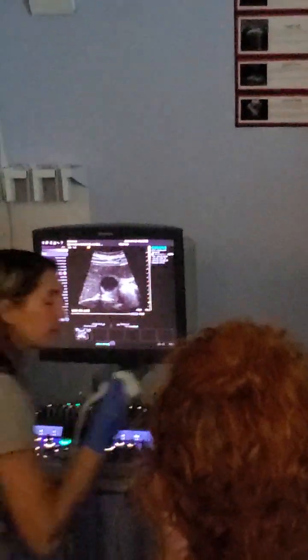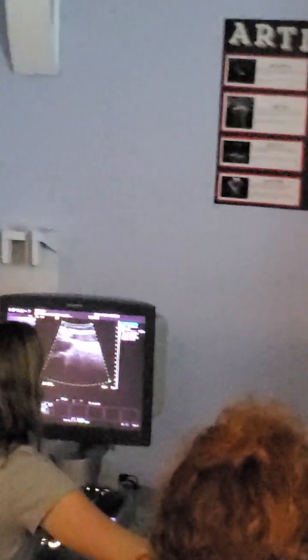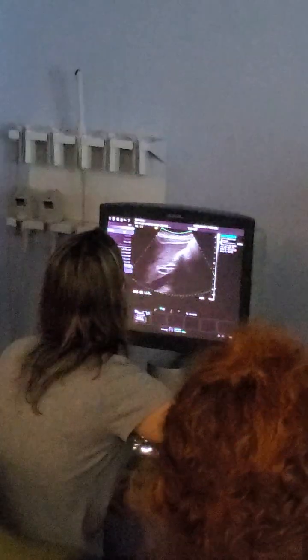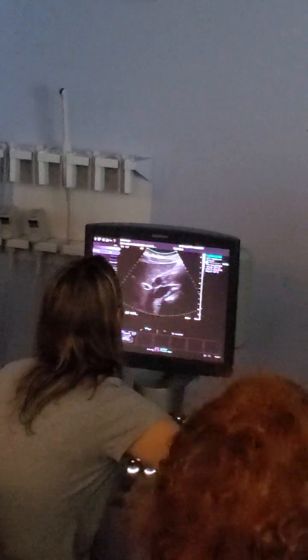Yeah, let me take it. And this is like a pendulum, right? So we saw it before in one particular spot. And it might move. It might just move. It might be over in the left or below. It might be way over in no man's land.